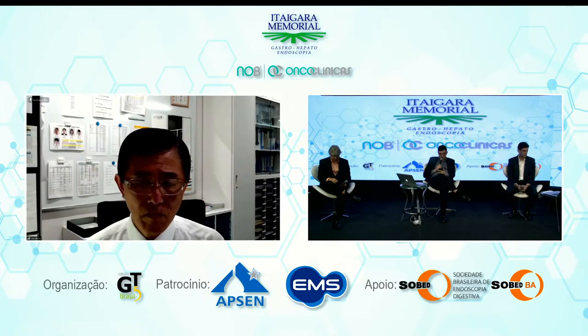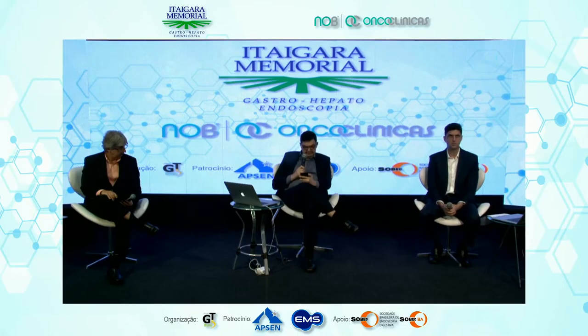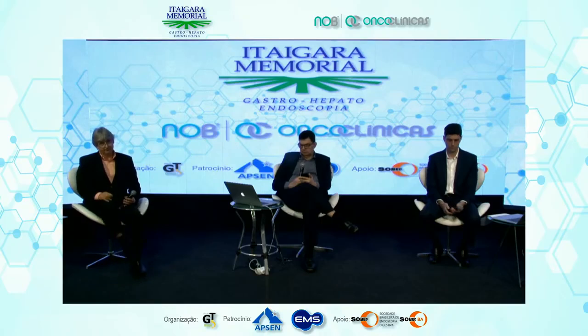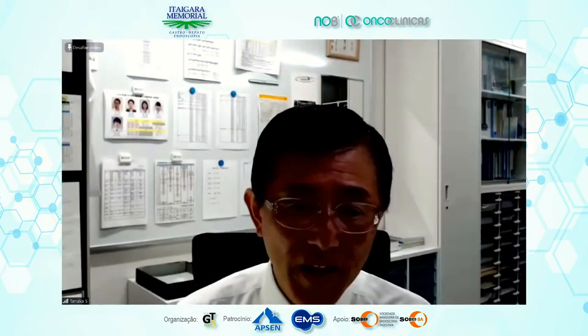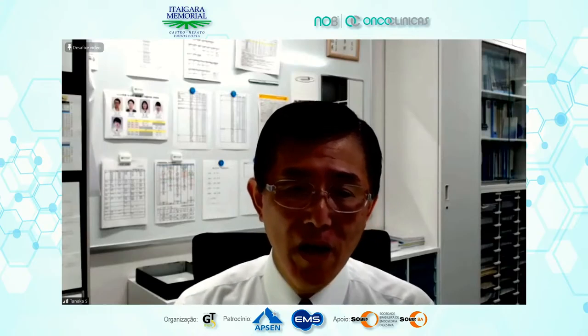Sensei, we have a question from Professor Nelson Miyajima. In rectal lesions, the criteria for a cure could be extended to more than 1,000 micra if there are no other risk factors. 2,000 micra? 2 millimeters?